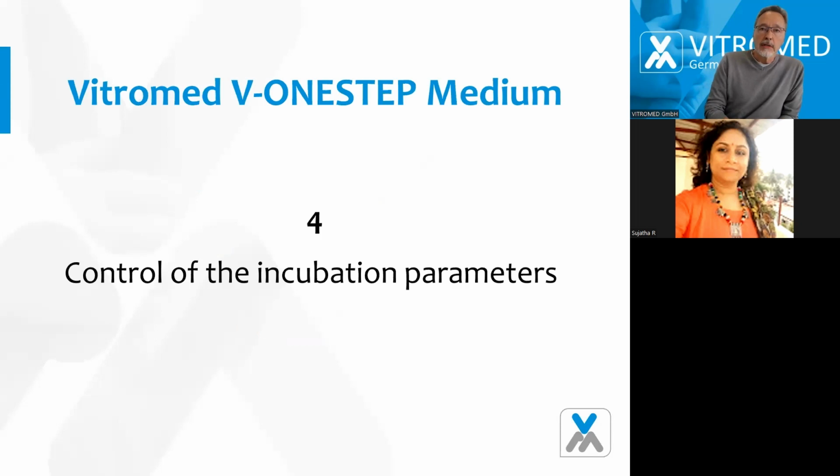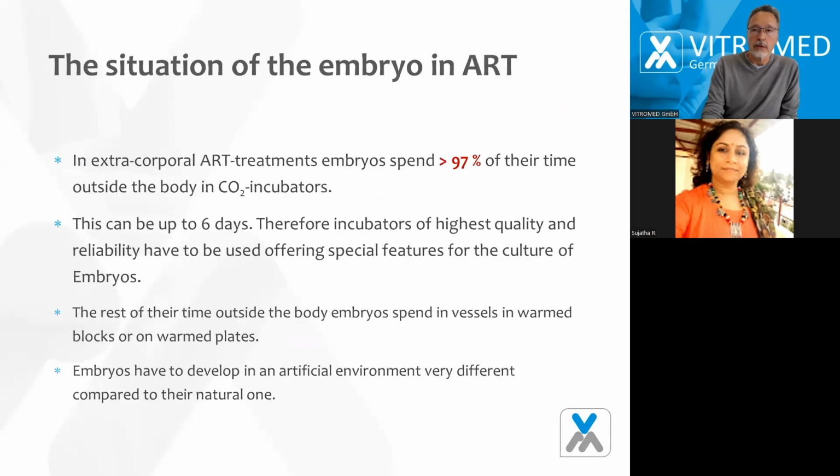Okay, next point is the control of the incubation parameters. This is a very important thing in IVF. You have to look at the situation of the embryo in ART. In extracorporeal ART treatments, like we do, ICSI and IVF, embryos spend 97% or even more of their time outside the body in a CO2 incubator.